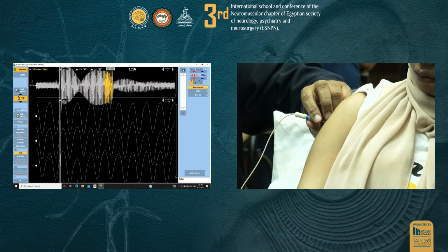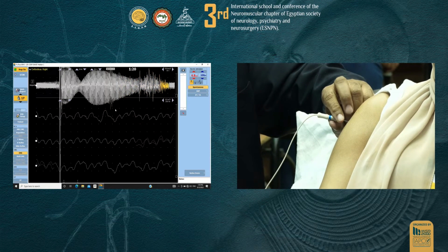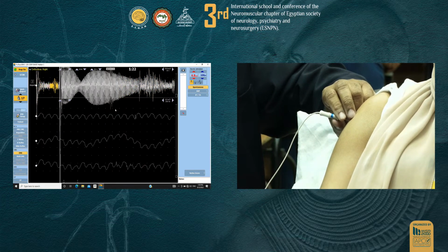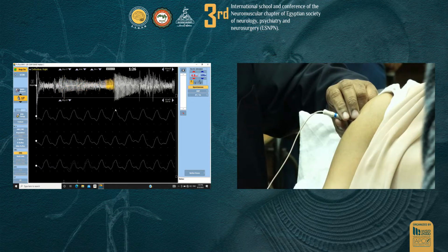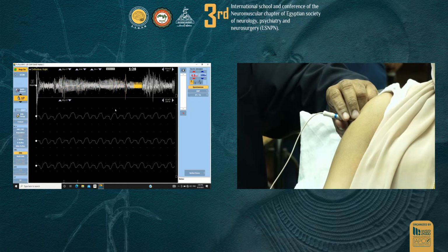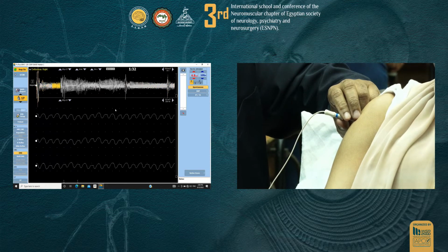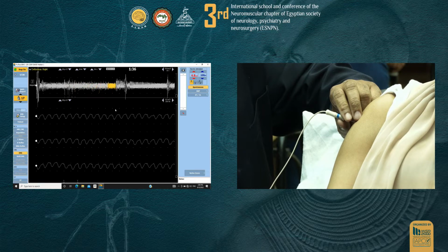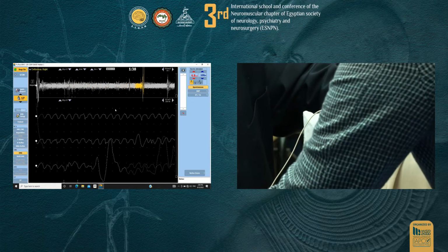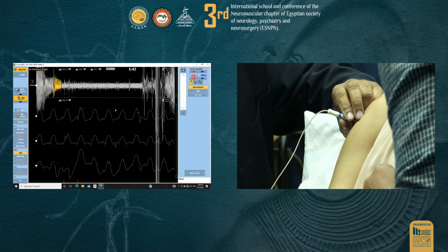There's a lot of. Am I in the right? Yep. Yesterday it was doing pretty good. There's a lot of artifact going on. You want to put more gel?